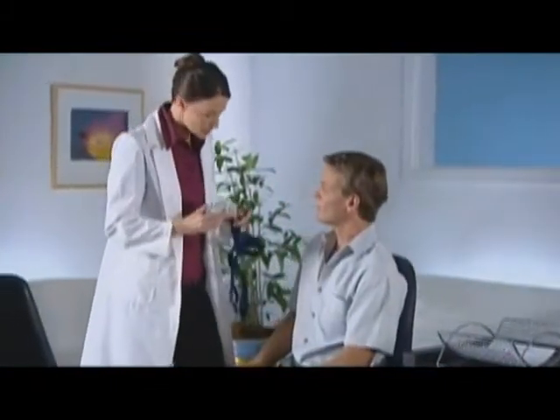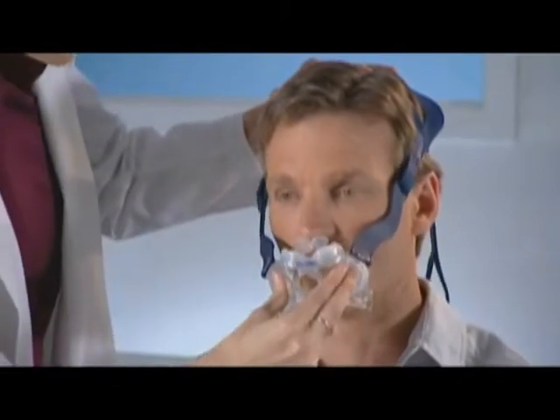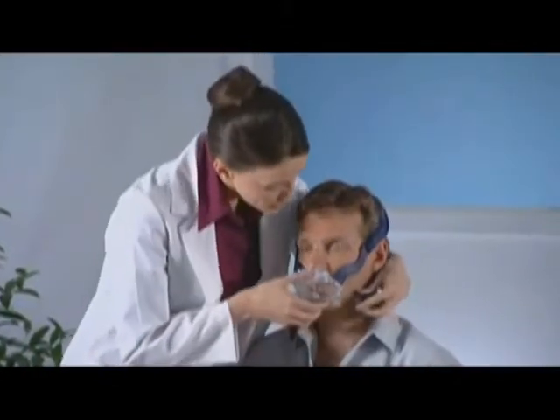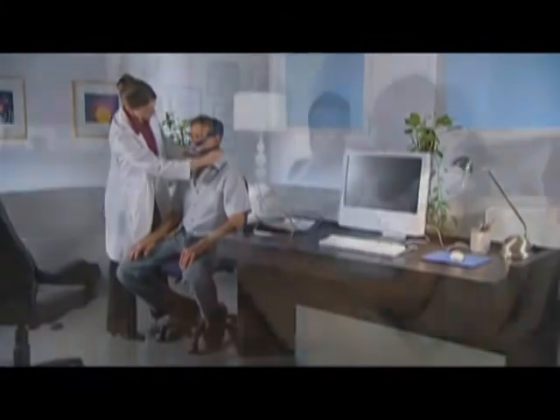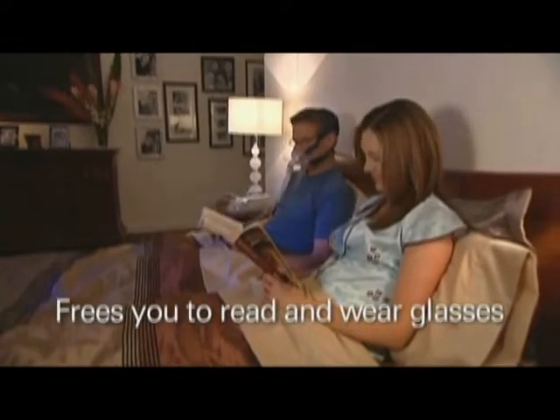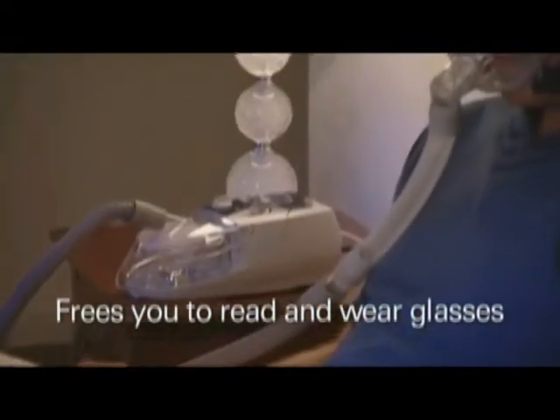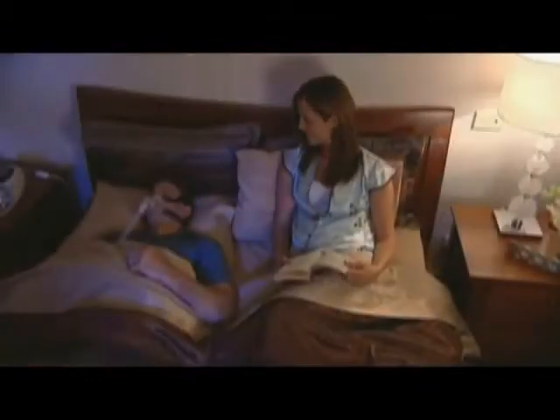Your healthcare professional has recommended the Mirage Liberty Full Face Mask, the easy to use, next generation Full Face Mask from ResMed. The Mirage Liberty offers innovative design and fit that frees you to read, wear glasses, and of course, help you get a good night's sleep.